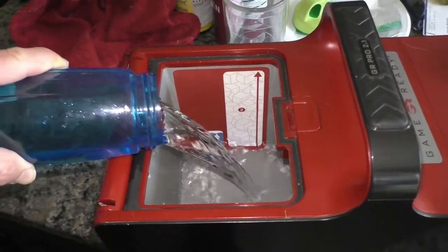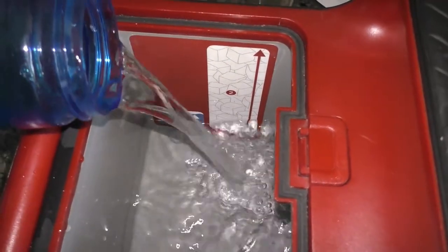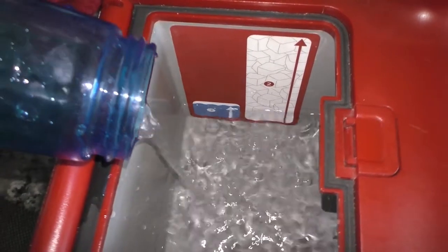Step number one is to pour water into the unit. You will need around five cups of water to hit the mark where the arrow is.